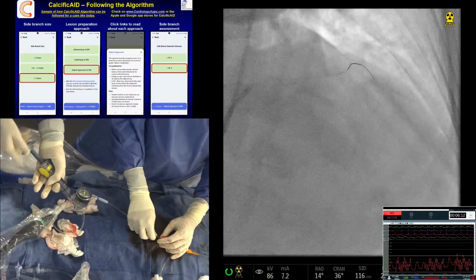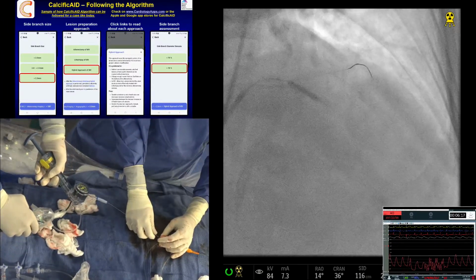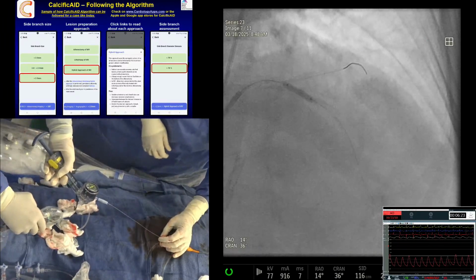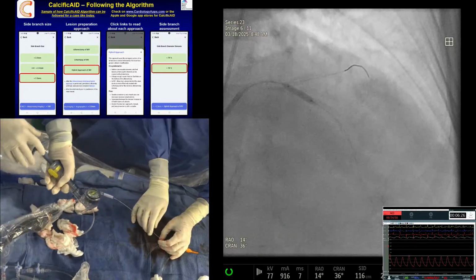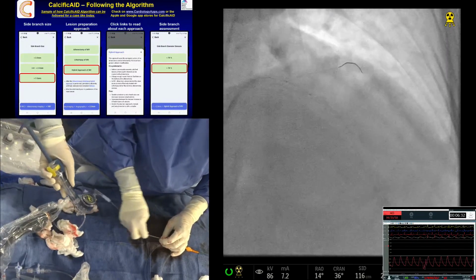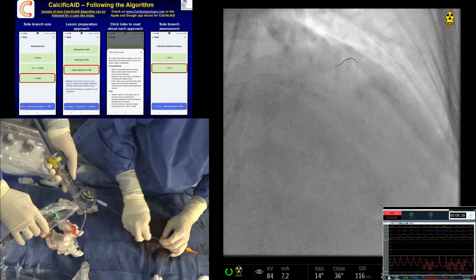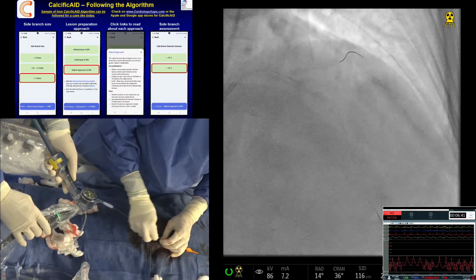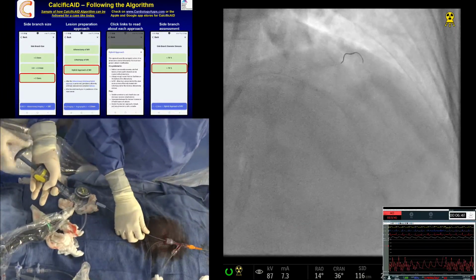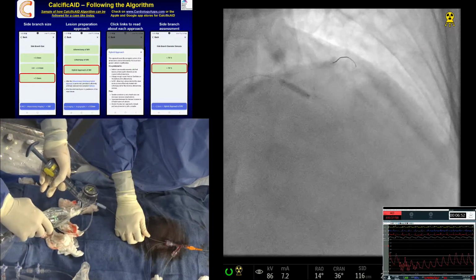So that actually was a downside of the 1.5 burr. It did go. It was tough, but as Anup mentioned earlier, it has not done much to the plaque. So it's always a trade-off. It looked like at that point 1.5 was okay, but we are struggling now. And we know that 1.75 could have been a totally different story. A safer choice, but inadequate ablation.